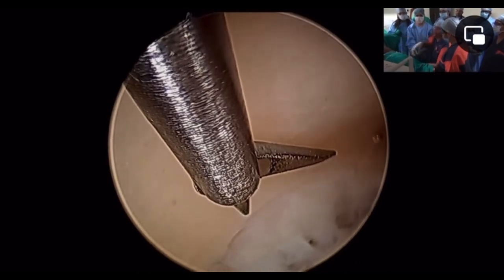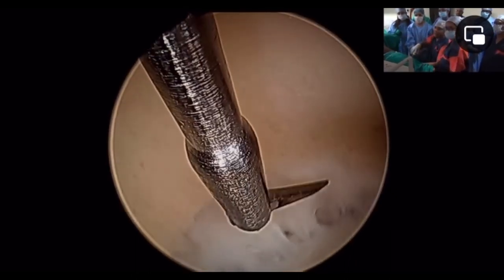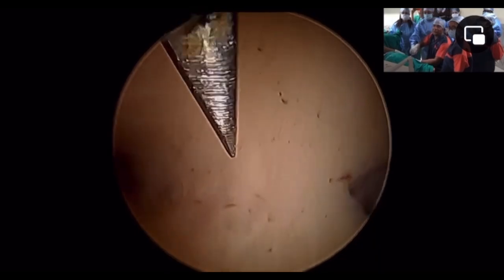So here I am guided by the ultrasound preoperatively, not during the operation. Ultrasound preoperatively informed me that the myoma is in that location, fundal, and told me the distance between the endometrial cavity and the myoma. So I have to cut into this white myometrium.